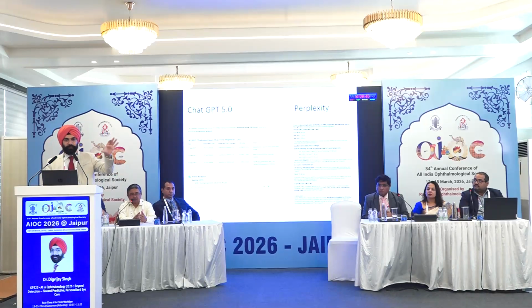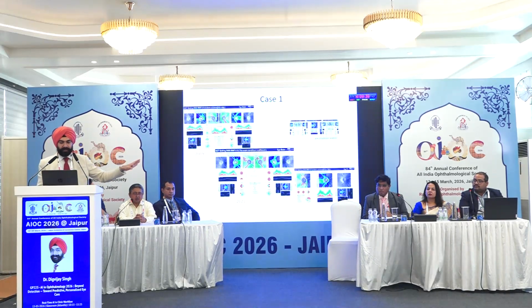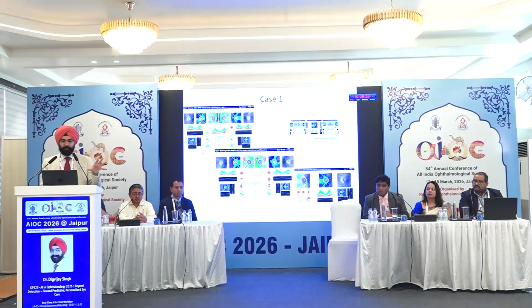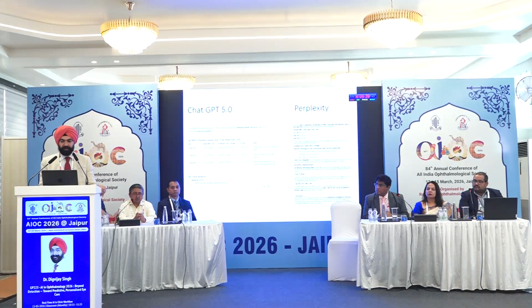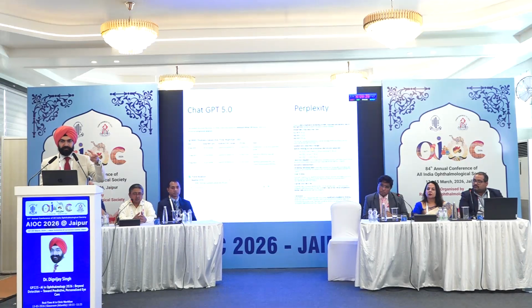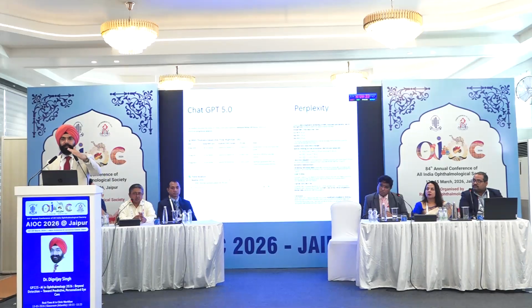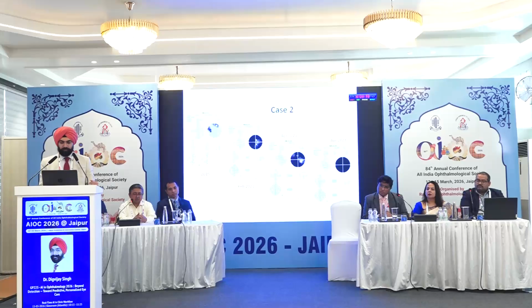It will put the values of each of the scans. So if I ask it only to analyze the right eye, because I've got one of the right eye here, the others are all bilateral eye, it will automatically pick out the right eye, put the values, tell me that there are some changes or some progression happening. It will give me the interval difference, and it will also give me sort of what we get in the visual field index. It tells us by when the progression will get worse the next time around, and it gives you those sort of outputs.